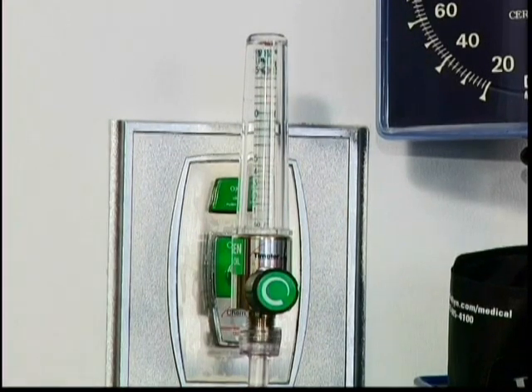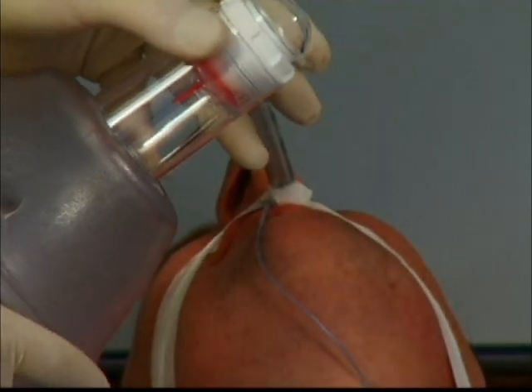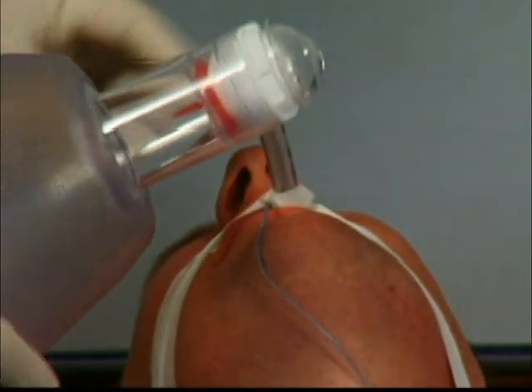Recheck to make sure the oxygen flow meter is set to deliver flow at at least 15 liters per minute. Connect the patient connector on the bag to the connector on the endotracheal tube, or on the connector of the tracheostomy tube, being careful not to pull, tug, or dislodge the tube. Also, be careful not to crimp the endotracheal tube.